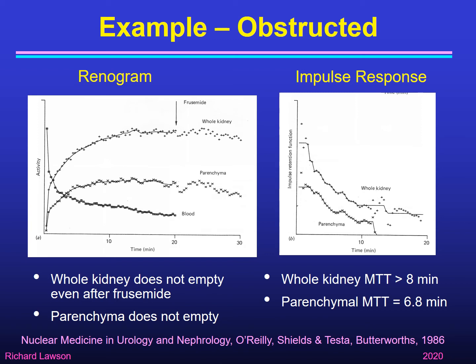But in Manchester, my routine is just to use the Diuresis Renography with frusemide. However, the series of patients where we went on to compare with deconvolution showed that the patient had similar results by mean transit time.